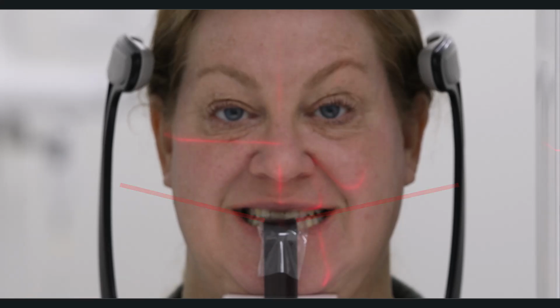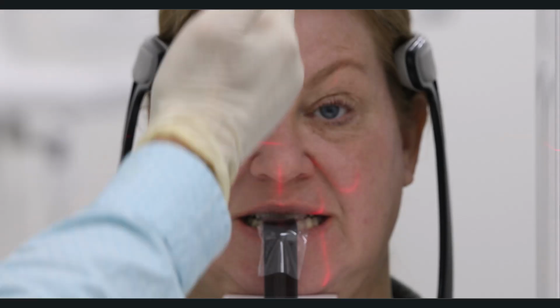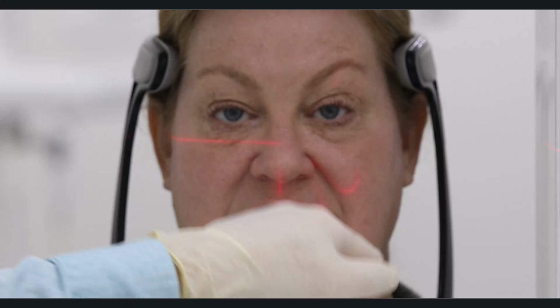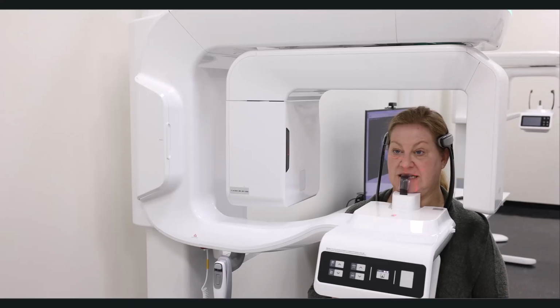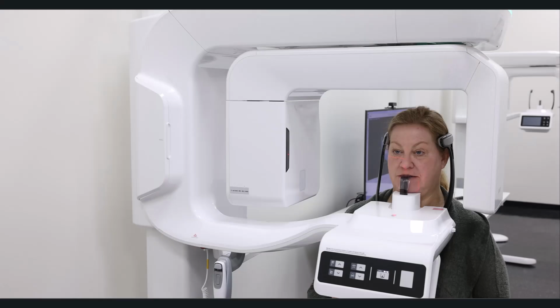Next, I'm going to go ahead and close my temple supports by clicking on the button here. Temple supports close, double check my mid-sagittal beam, and lastly, we have our canine light. You can see it shining on the left side of the patient here. To adjust that canine beam, I can use our slide bar and move this anterior to posterior. Go ahead and smile really big for me. Perfect. All right, go ahead and relax your lips. We have our patient positioned.